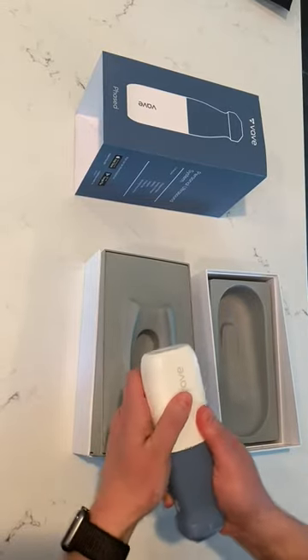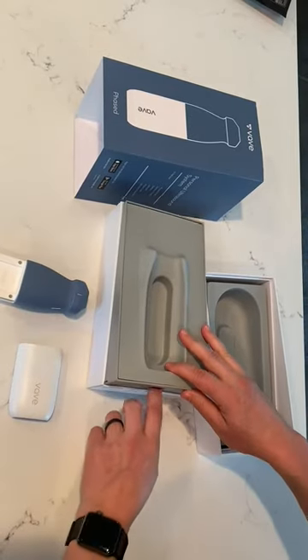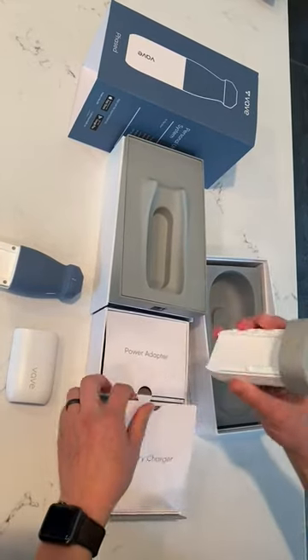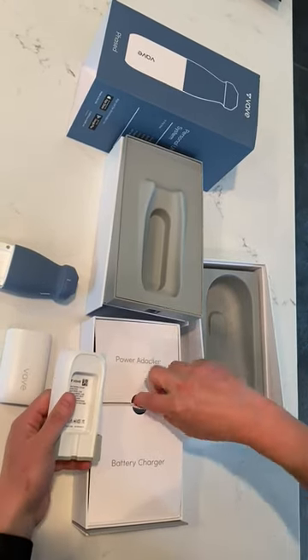And this is our battery right here. This comes off for recharging, so I'm going to go ahead and show you that part now. Again, your packaging will be a little bit different, but we have a power adapter and a battery charger. Here's our battery charger. What I need to do is pop the back off of this so that I can plug in my power adapter.